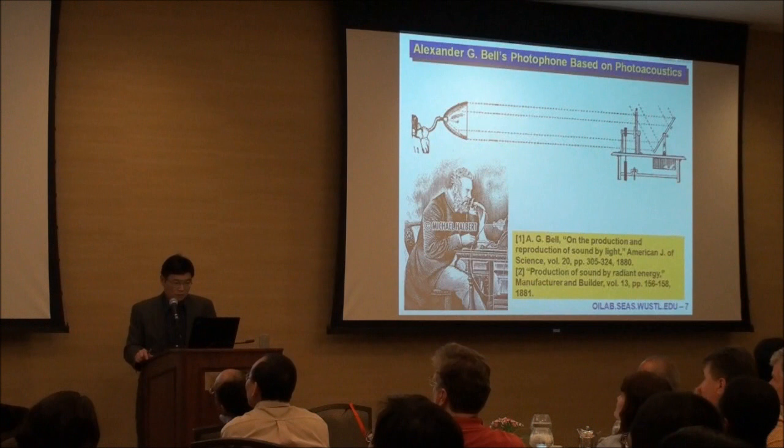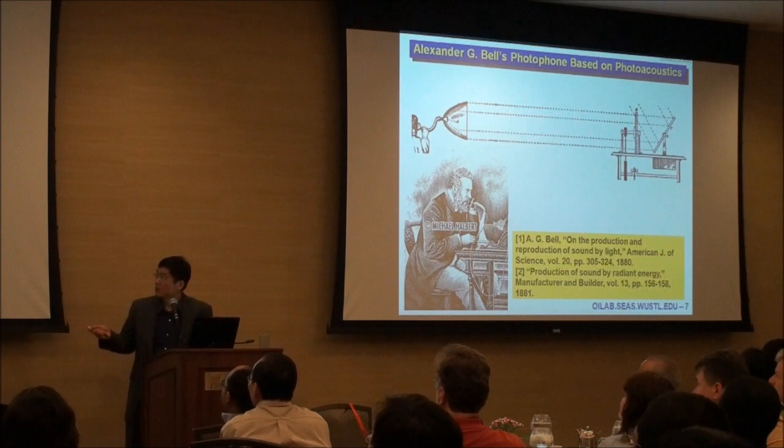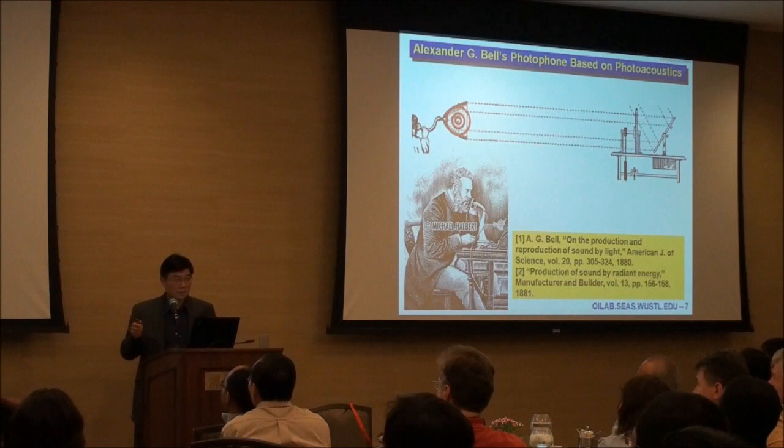Photoacoustic tomography is based on the physical phenomenon of photoacoustics, which was first reported over 100 years ago by Alexander Graham Bell. He had this idea of a photophone instead of a telephone. Of course, this idea never took off. The basic concept is to encode sound into a light beam, propagate the light beam in space, and convert light back into sound again through the photoacoustic effect.